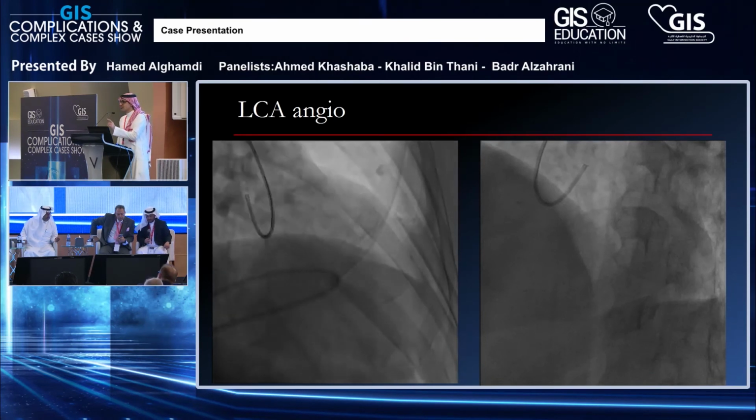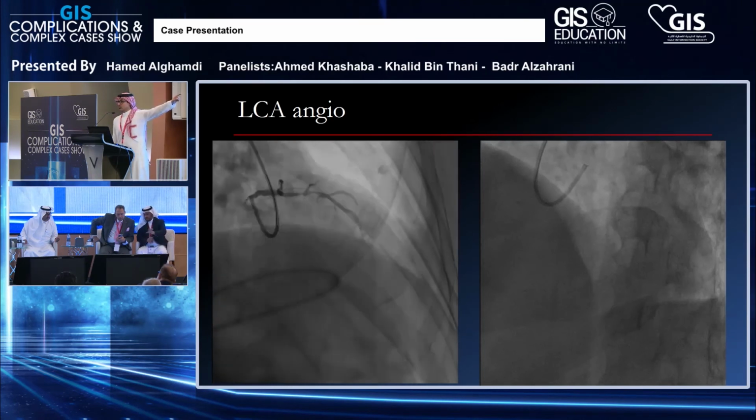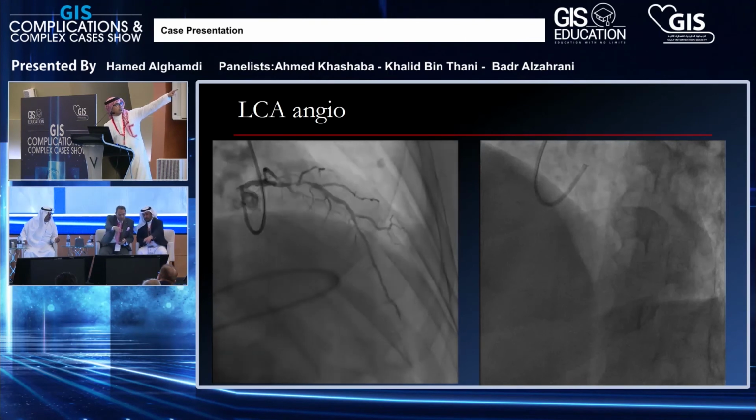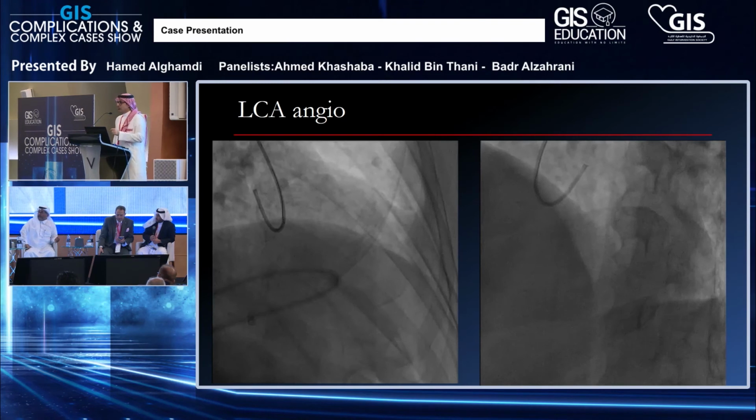With IVUS, it showed very severe disease even after that second diagonal. It was very severe disease. Okay, so just distal to that diagonal. I thought it would be better, because you're going to be chasing yourself. And by the way, the problem happened not after the first or second stent, it's actually after the third stent. The one that you were proposing, just to do it up front.